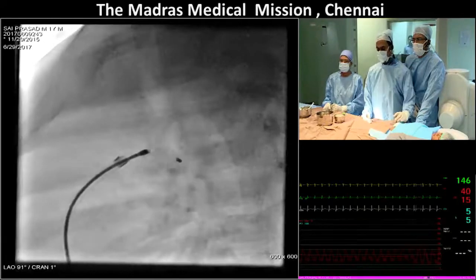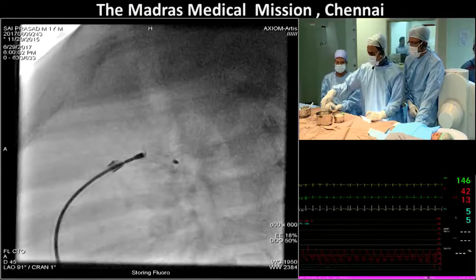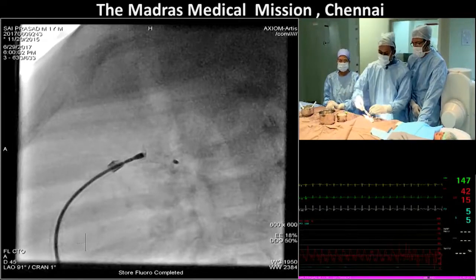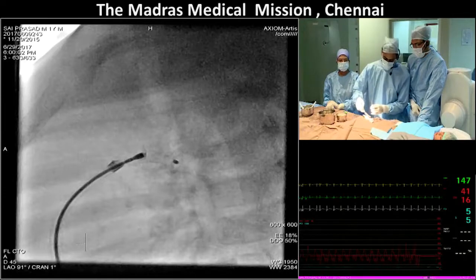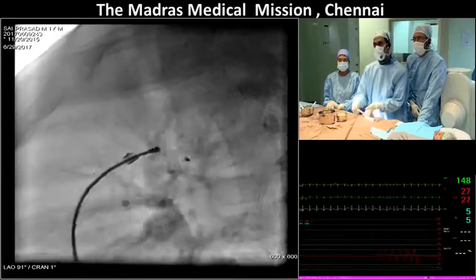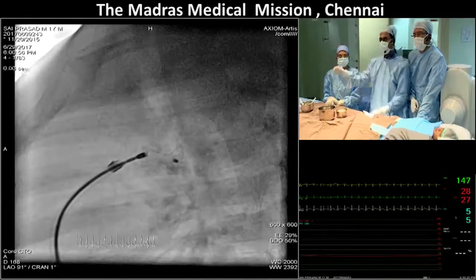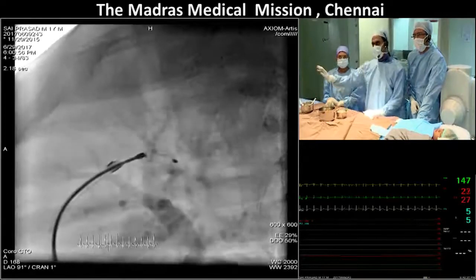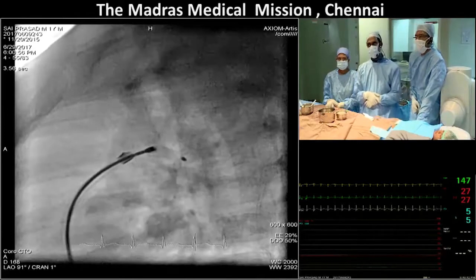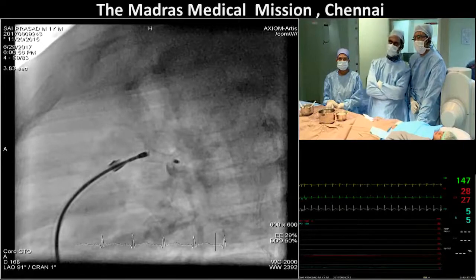At this position, I make a second angiography and observe a long levophase which fills the aorta, and thereby checking the aortic position also. I'll show that now. So we wait for the aortic levophase. Show the picture again now. Freeze it. This is the aortic levophase. You can appreciate that the device is on the anterior wall of the aorta.